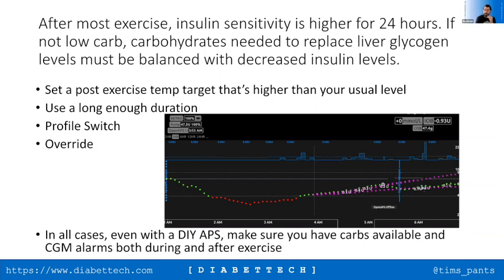Yeah. So this is one of the things I found particularly hard about trying to use commercial systems, is that they give you no information about IOB. And if you're exercising and you're used to exercising and looking at your IOB to make that call, it becomes really difficult to actually do anything when obviously you can't see that information. And that's quite an interesting piece of feedback to commercial options, is that if you don't know what your IOB is, it can be a challenge.